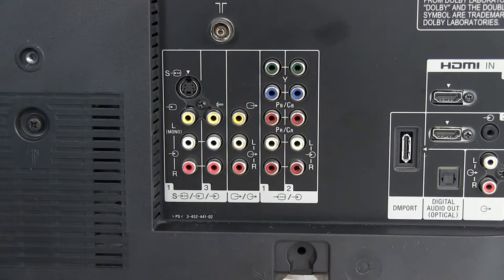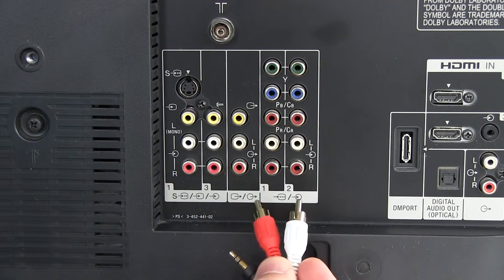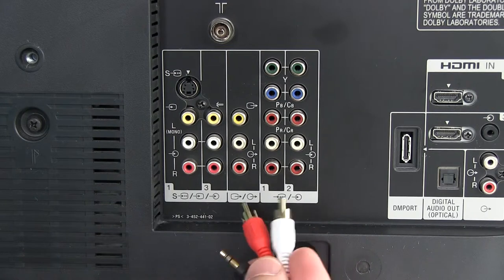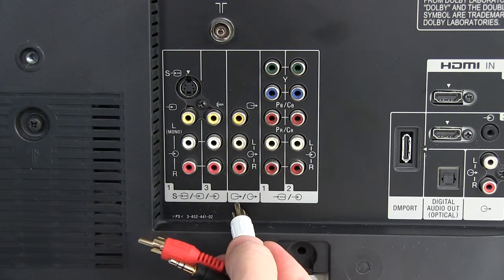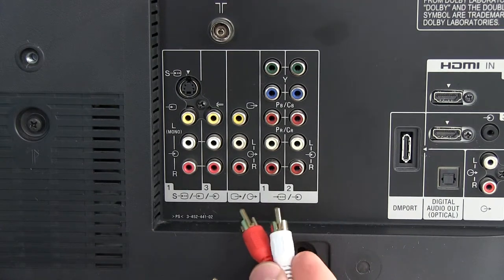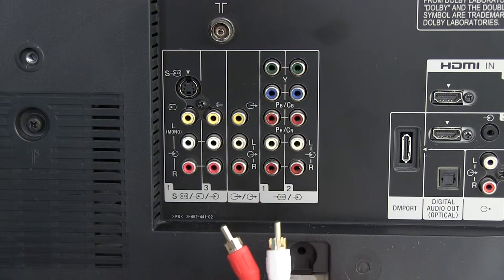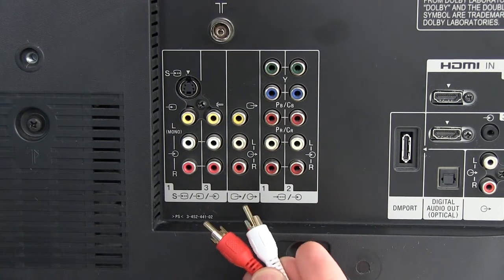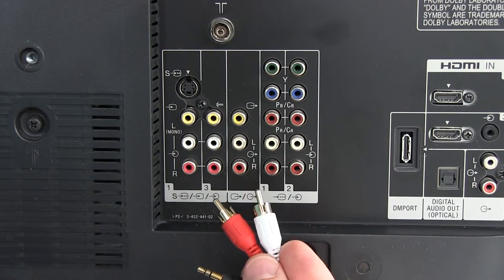With most TVs, you're looking for the analog audio output jacks, and hopefully it will be written in plain English as 'audio out.' In some cases, you'll need to look for a symbol or consult your TV user manual. In this case, the Sony TV has a symbol showing an arrow pointing out, which indicates that it's an audio output. So you would connect the red and white connectors to the red and white of the audio output jack. That's your most basic setup for the TV streamer.